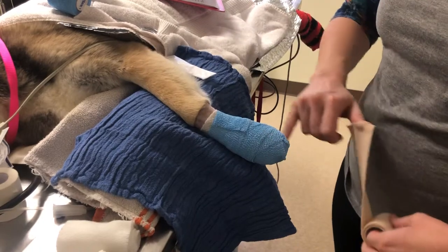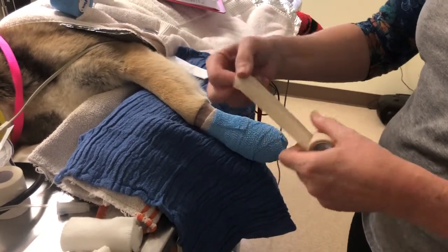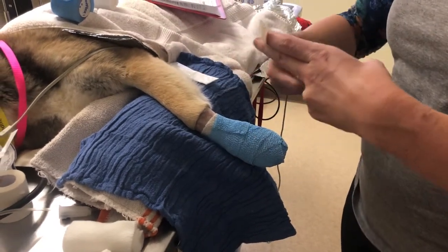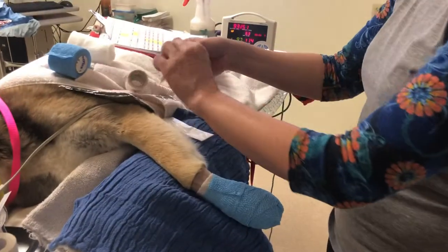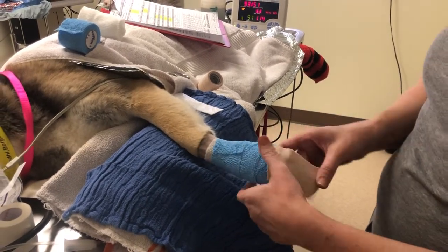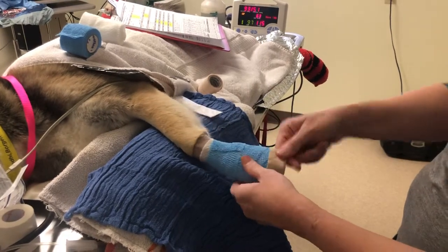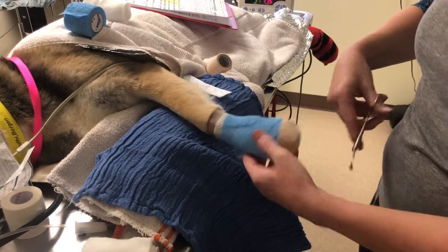I'm going to make a sole-of-the-shoe protector with this elastic, to protect where the bandage gets the most wear and tear. I just cut off a couple of inches, lay it across the toe area, wrap it up the side, pinch it, and trim it because I like it to be neat and tidy — but it doesn't have to be perfect.